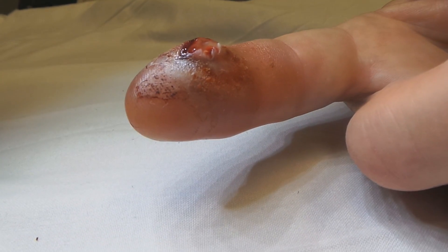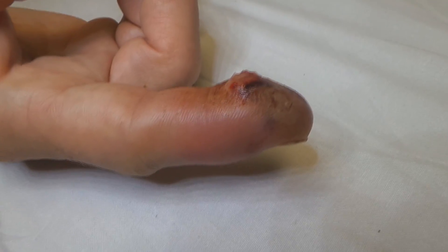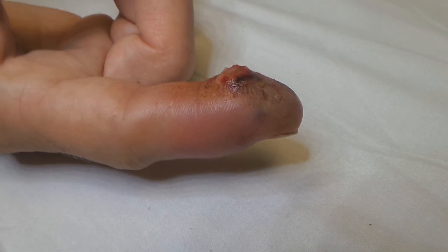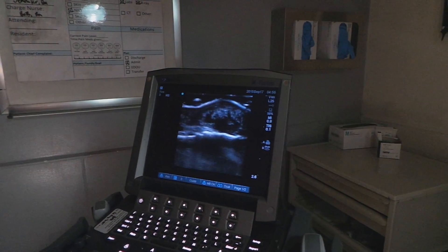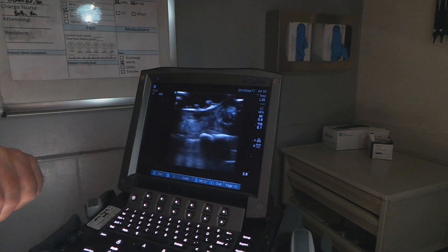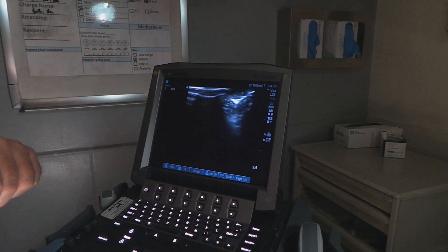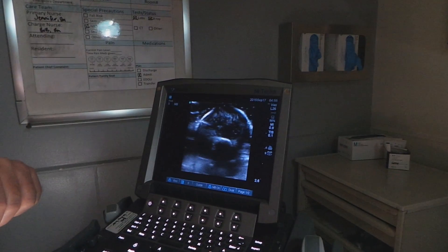Just little white specks, but that was it. The management of felons is sometimes complicated — whether you should do surgery or not is still debatable, but you've got to have the right antibiotic. I'm thinking there's a little pus sitting right there. Let me turn sideways and put the gel back on — there may be a little pus sitting right over the vault.